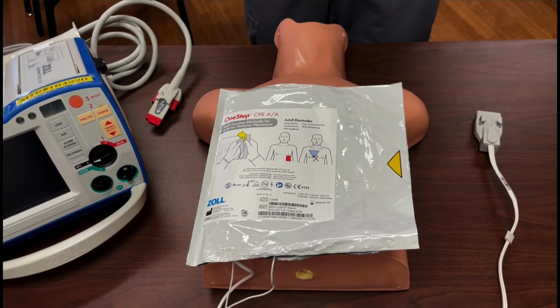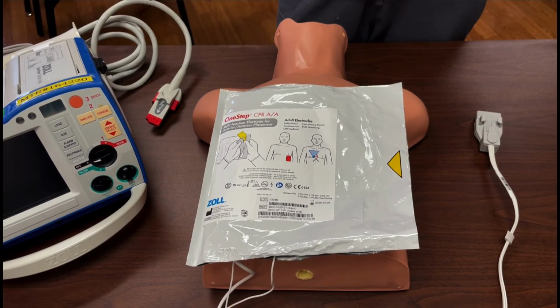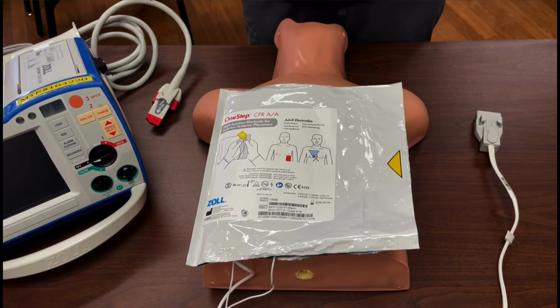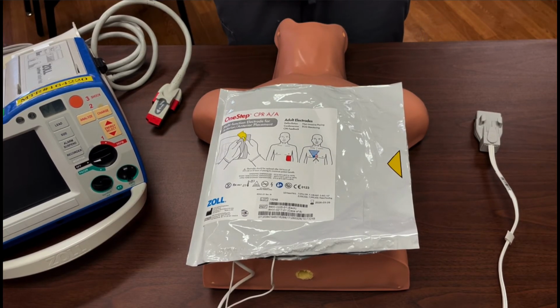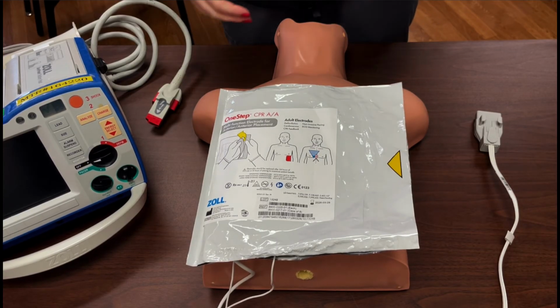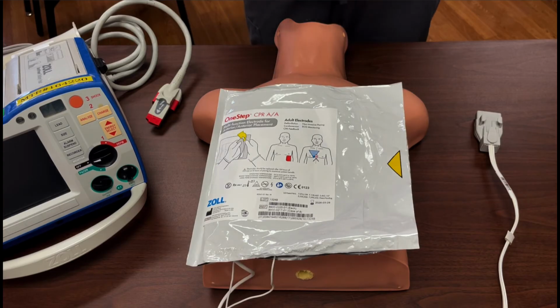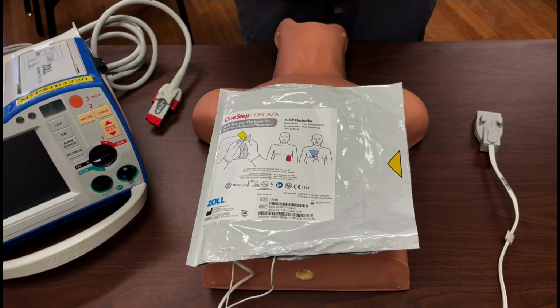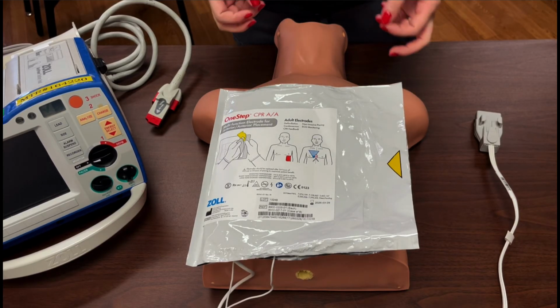Hi, my name is Dr. Lindsay Ritter. I am one of the intensivists over at MedStar Washington Hospital Center, and I am here today to show you the new one-step Zoll pads that are going to be implemented in our hospital in the next couple of weeks. I'm going to discuss the main differences, which include pad placement and the presence of a sensor called the puck and where to place it.